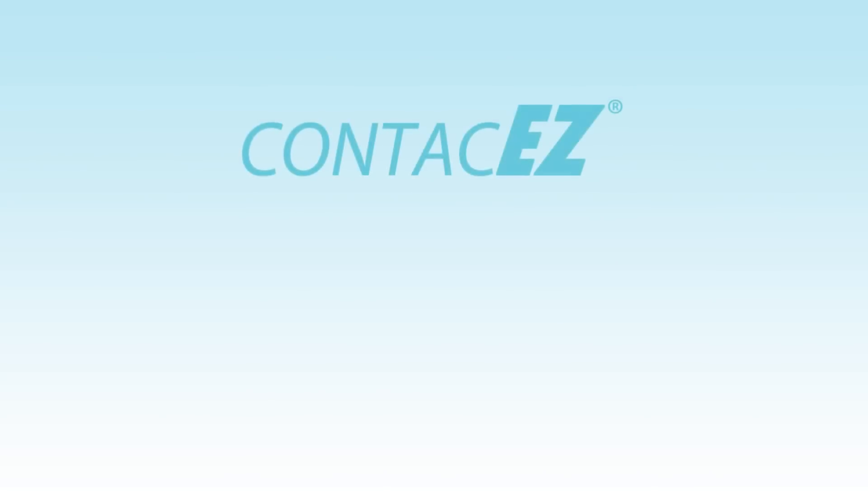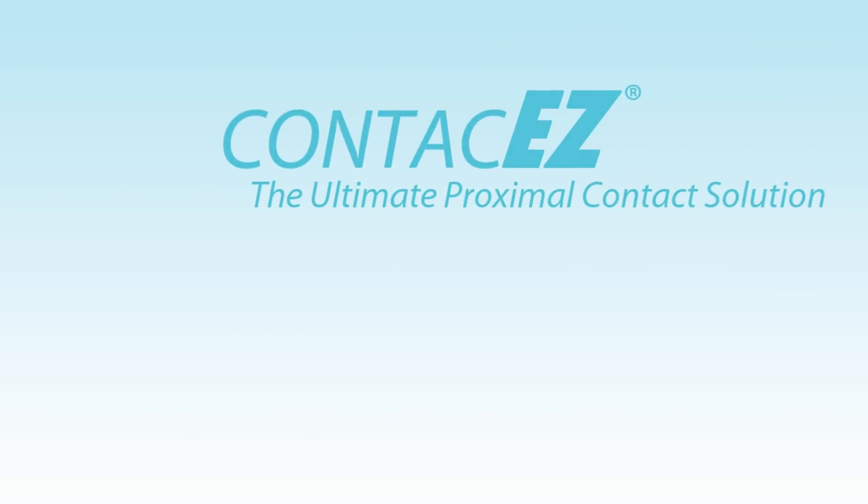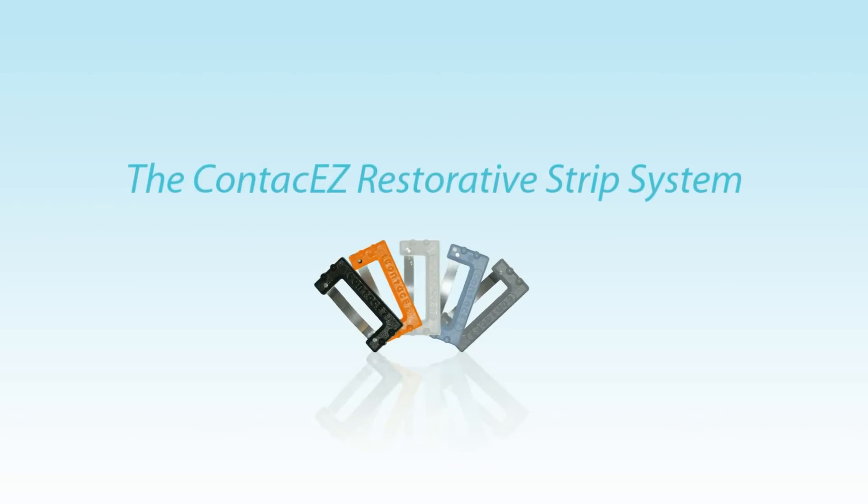Welcome to ContactEasy, the proximal contact solution. I'd like to introduce you to the restorative strip system. It's as easy as one, two, three.